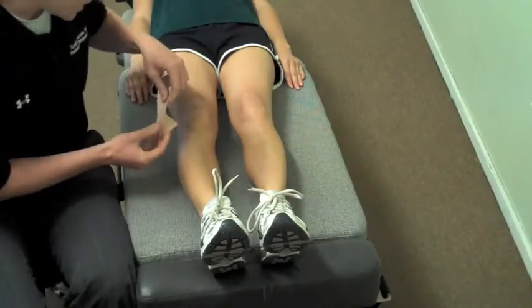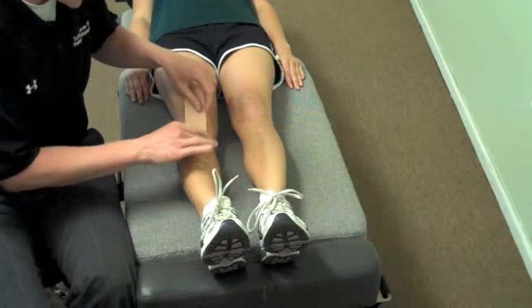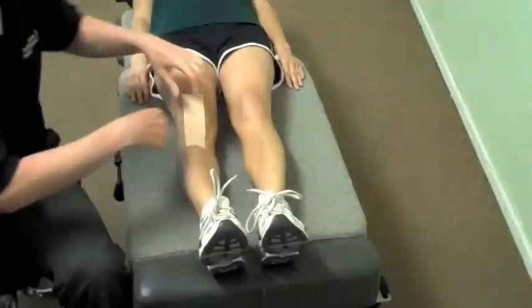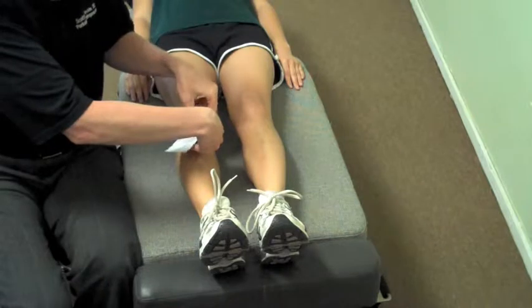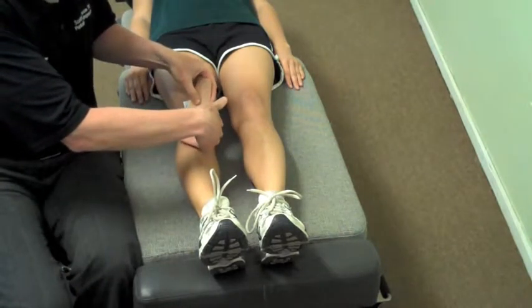We're going to begin by placing the tape at the inferior pole of the patella. Place it down at the base with no tension, and we're going to go with 55 to 75 percent tension to just the very inferior pole of the patella.